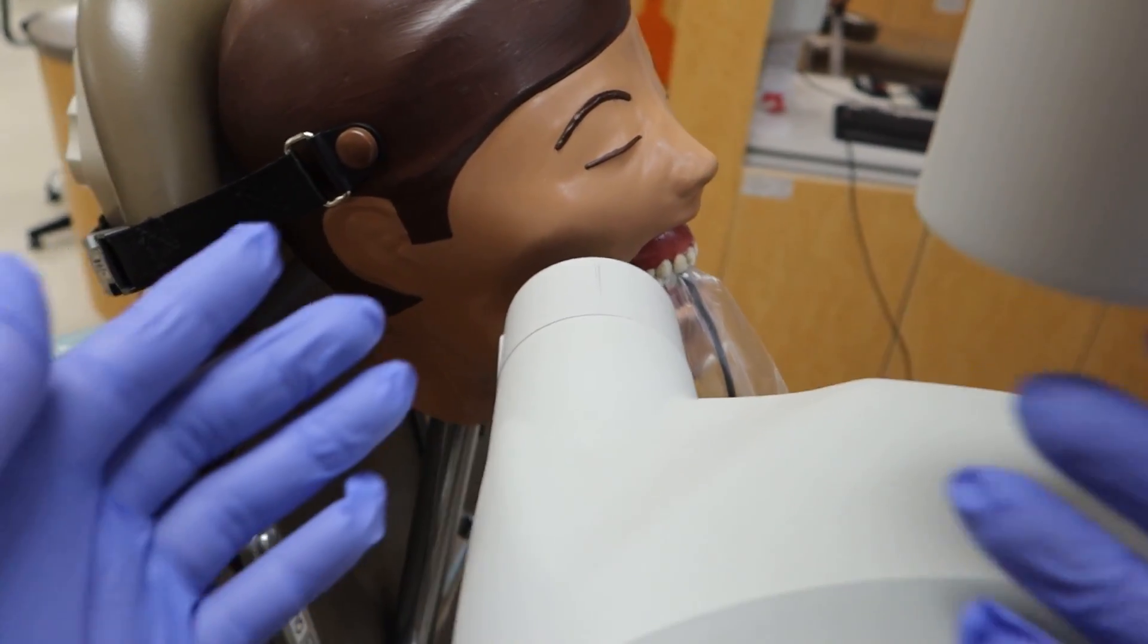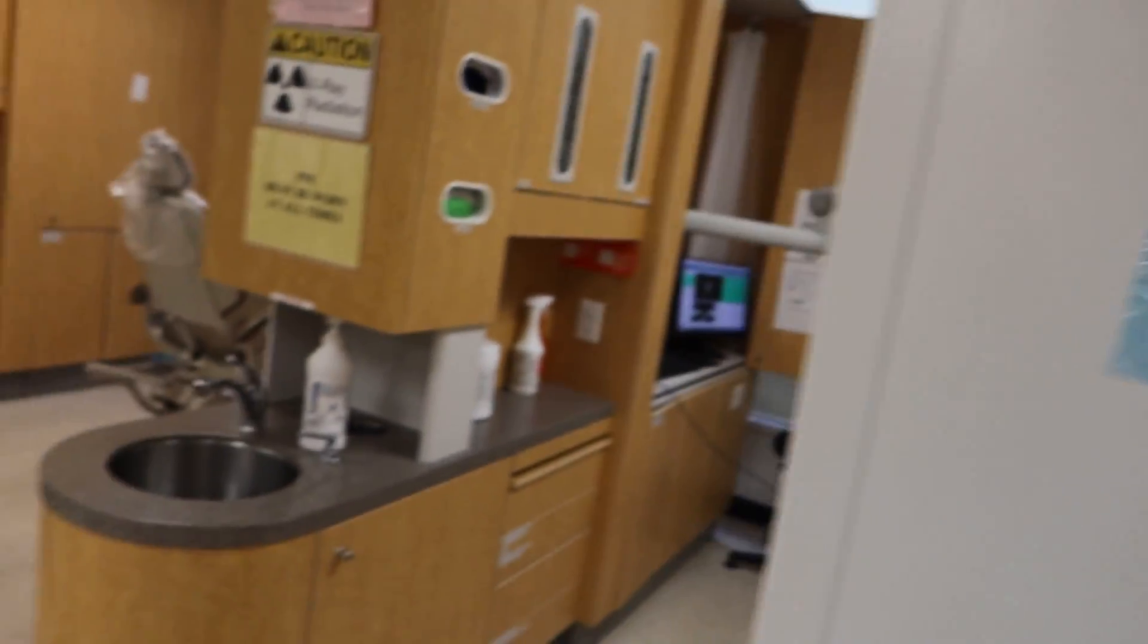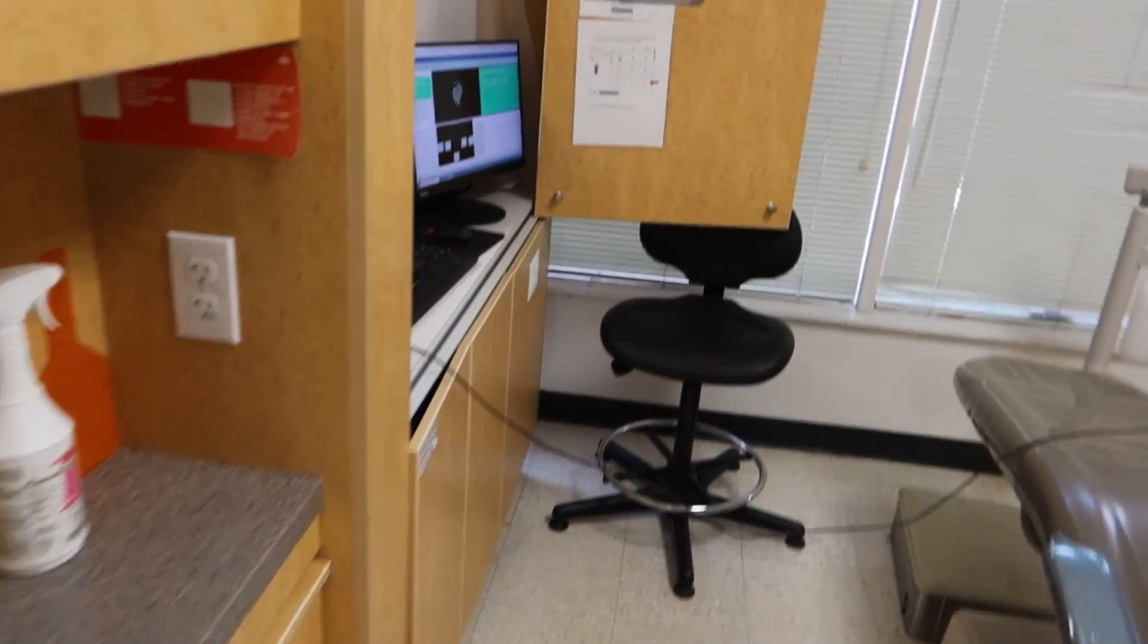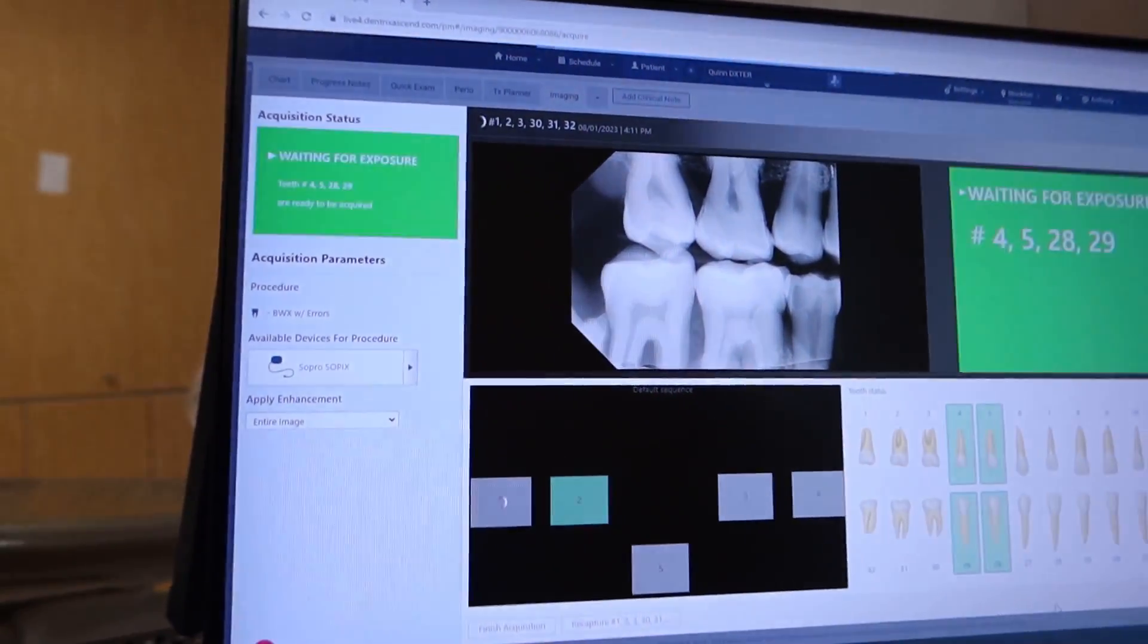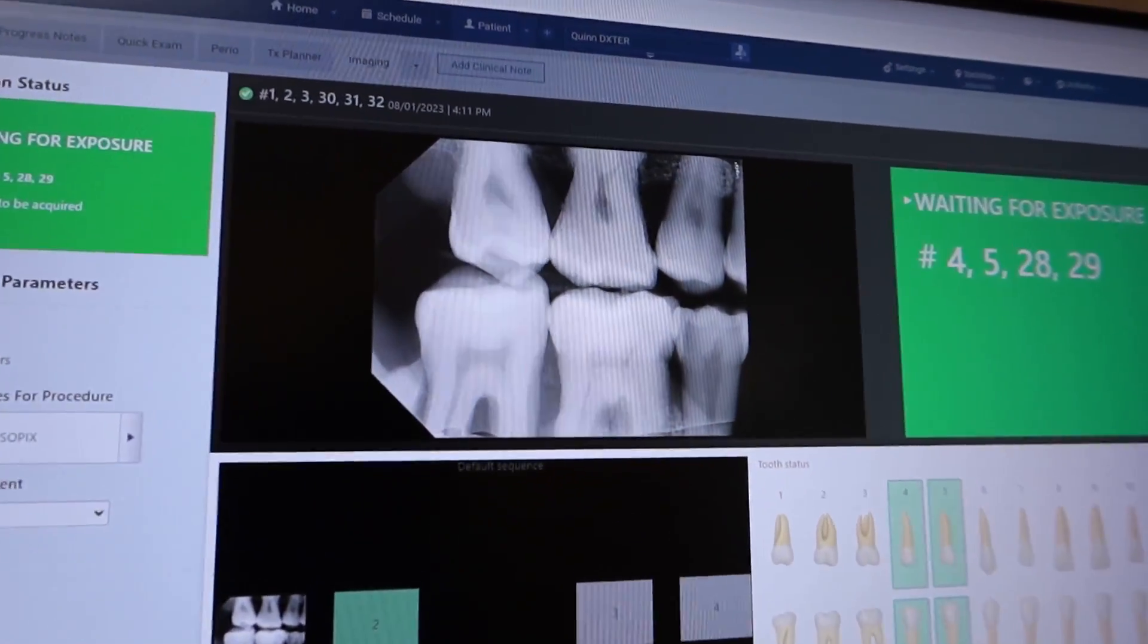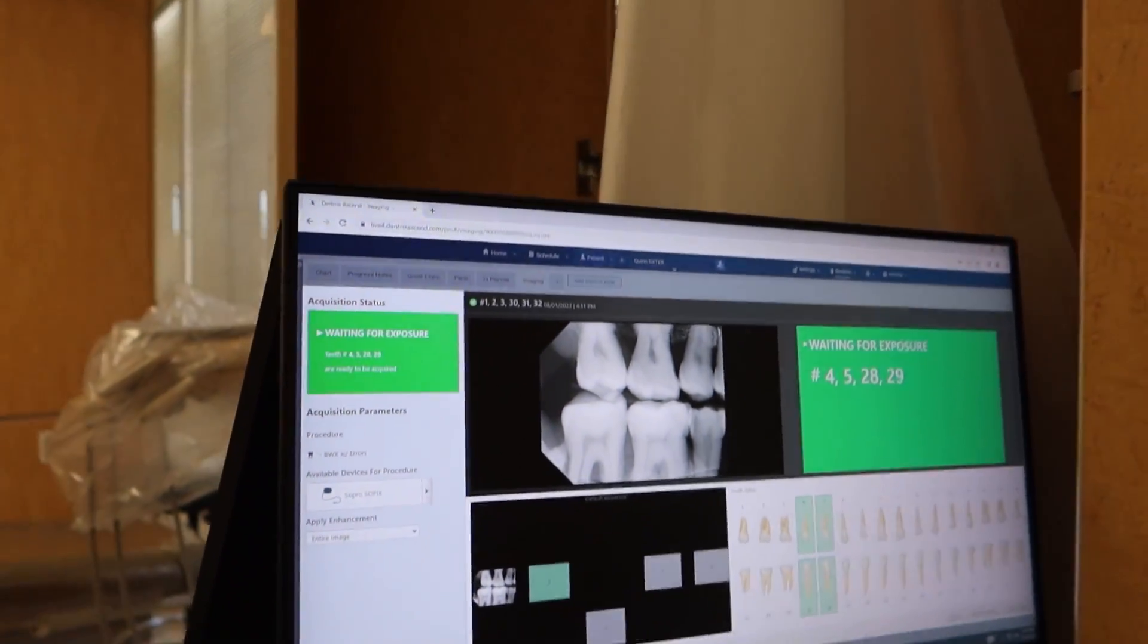With that, we can go and run for cover. And we just go outside, hold the button, yell clear. And we go back in to look at our results, which right here, I can see I got a decent result, but I still have some overlapping that's happening on some of these photos. So we can go make some changes of that.